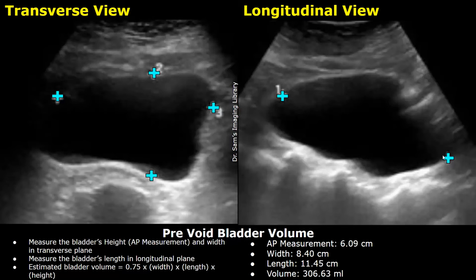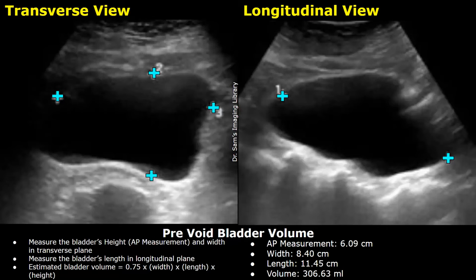Now we have three values: the anterior-posterior height, the width, and the length. We can use these three values to obtain the bladder volume — the pre-void bladder volume. The ultrasound machine will automatically calculate the bladder volume once these three measurements are taken. Manually, it is calculated using this formula: estimated bladder volume equals 0.75 multiplied by width, by length, by height. The values are in centimeters.